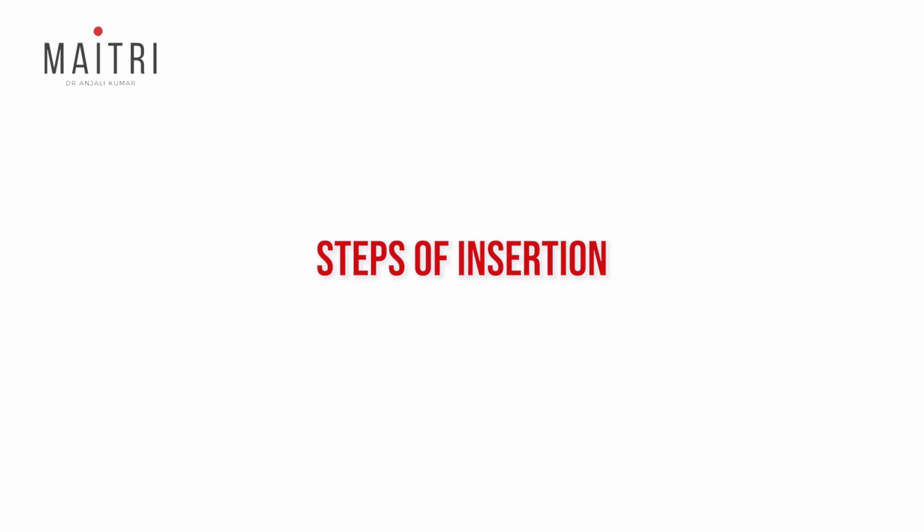Then let's talk about the steps of insertion in detail. The first step is to sterilize the menstrual cup when you are using it at the beginning of the menstrual cycle. Let the water boil in a pan, and once the water starts boiling, put the menstrual cup into it and let it boil for about 5 to 7 minutes. After that, wash your hands, and with washed hands, take the cup out. Now this cup is ready to be used.